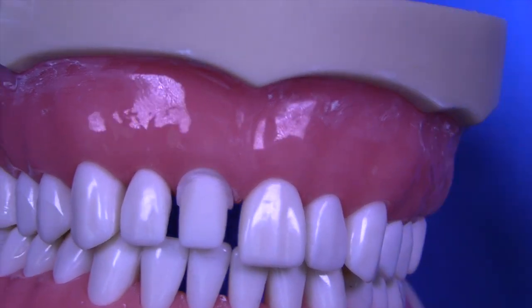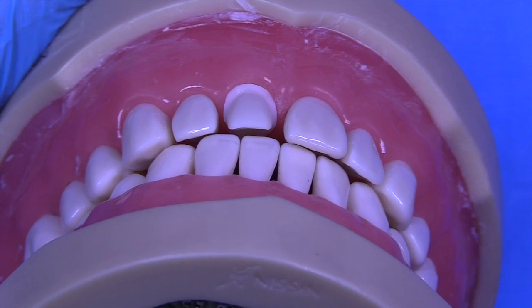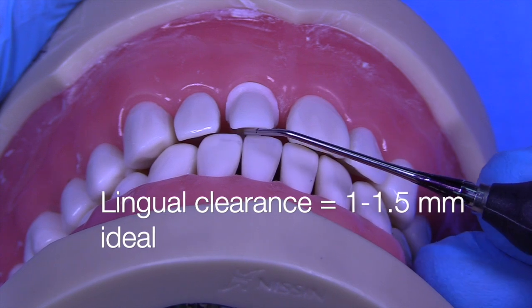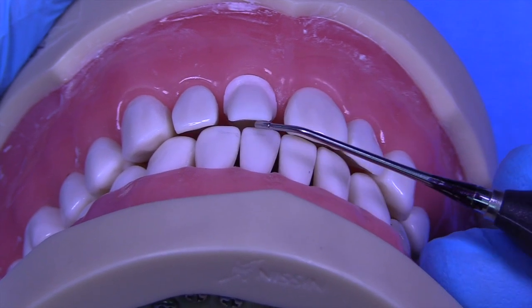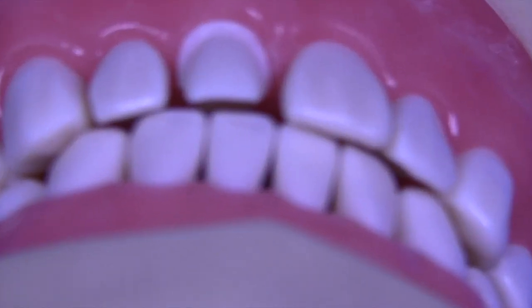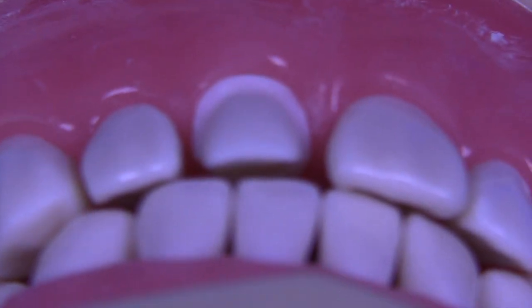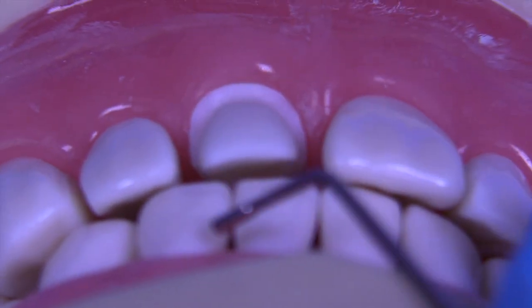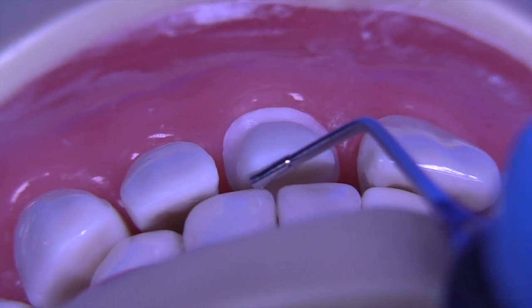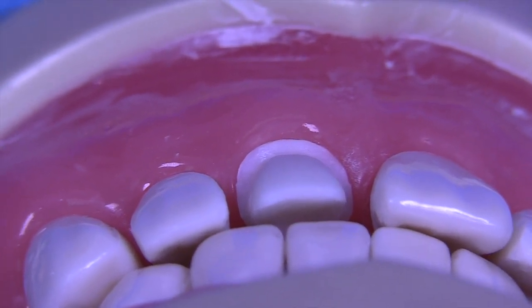Now let's take a look at the lingual view. Now the purpose of this view is not only to look at the facial reduction, but also take a look at the lingual clearance. So the clearance of the lingual in this case should be at least 1 millimeter. And I try to get the RGS instrument to fit, and it doesn't quite fit. So let me put this here and focus a little bit. You can see that we just can't quite get this to fit in this area. So you're a little bit less reduced than you should be in the ideal situation.